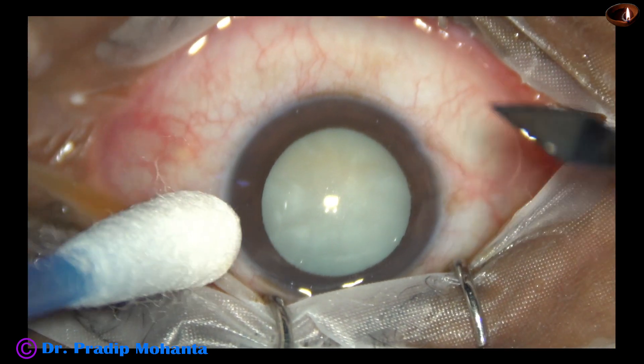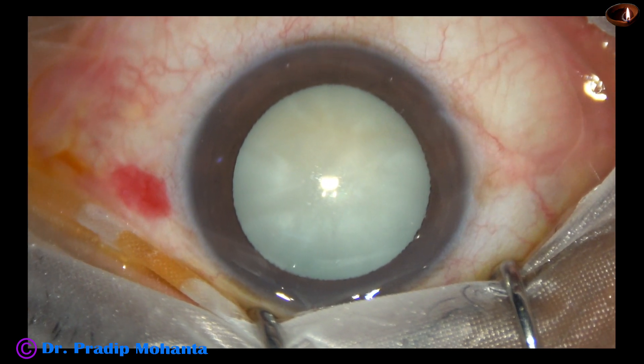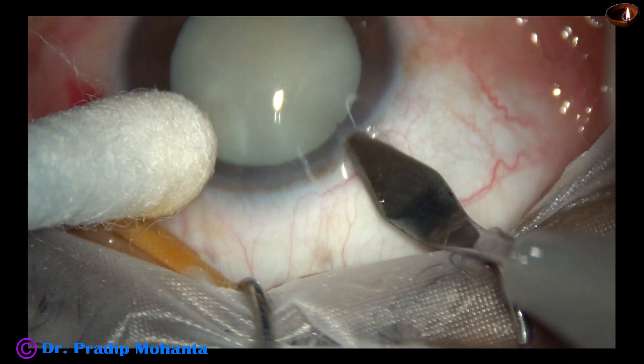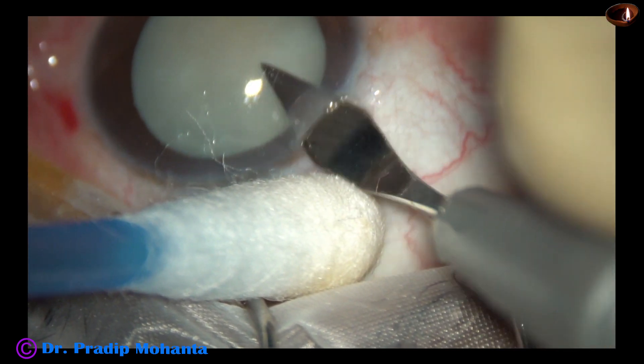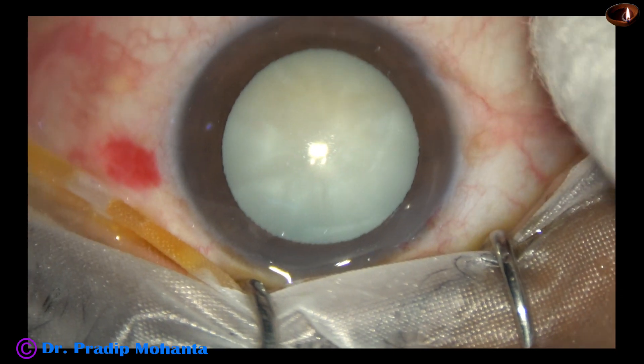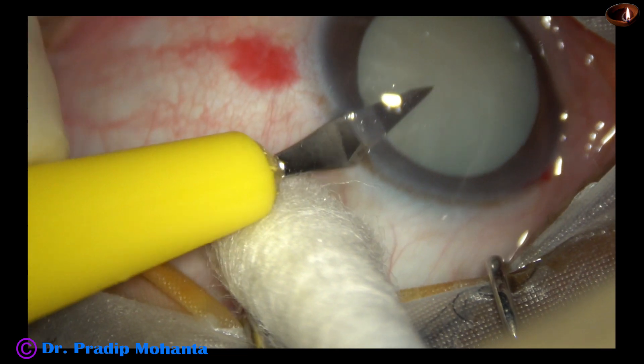The ocular surface is thoroughly irrigated, applying a few drops of 5% povidone iodine. Now the main incision is made with a 2.8 mm steel keratome. A side port is made on the left side of the main incision, about 3 o'clock hours away.